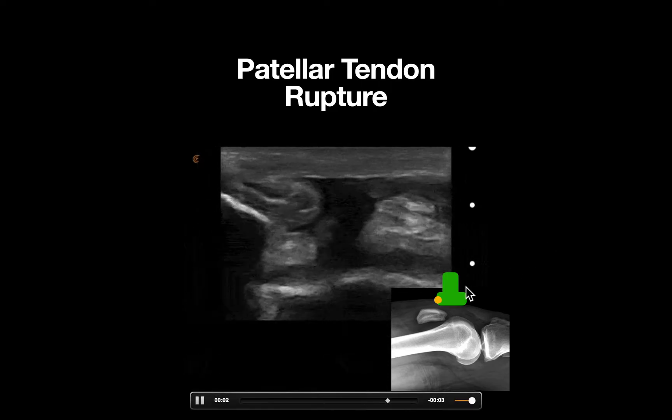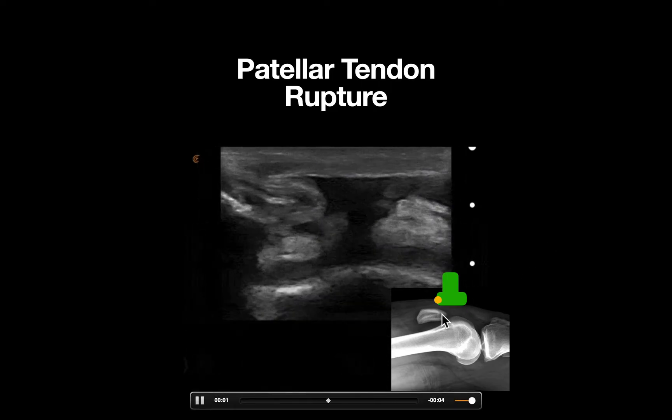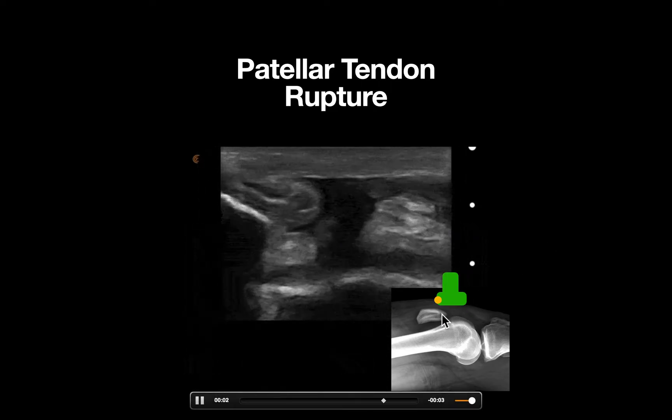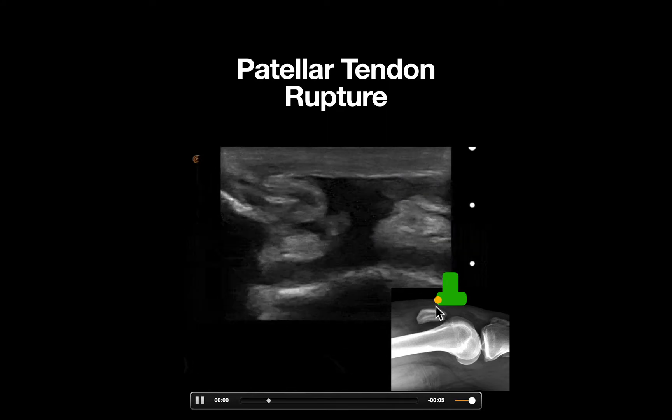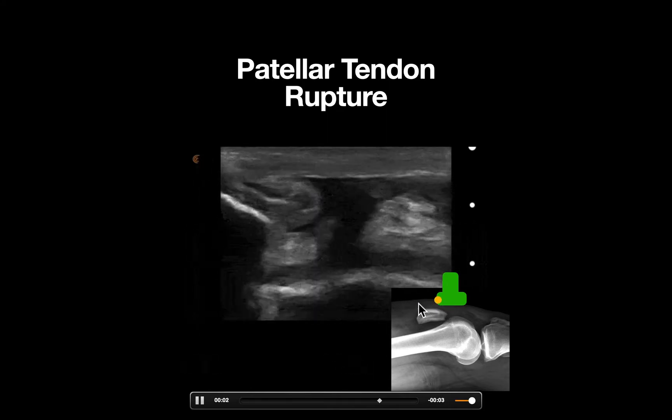A linear probe is used and placed at the distal end of the patella in a sagittal orientation, with the probe marker pointed towards the patient's head.